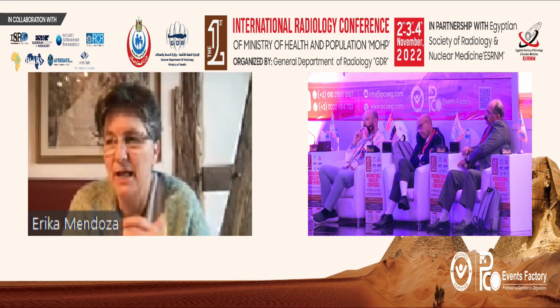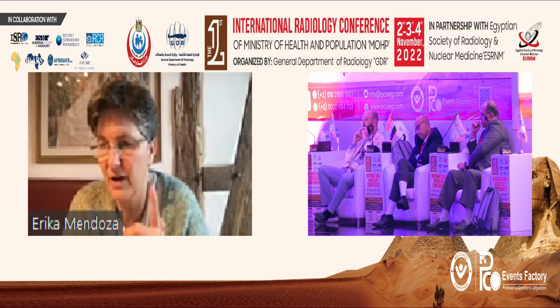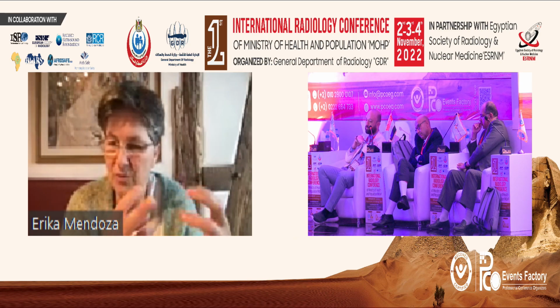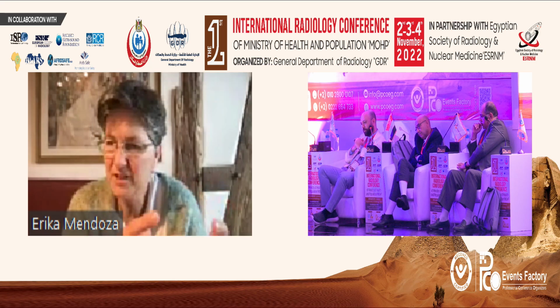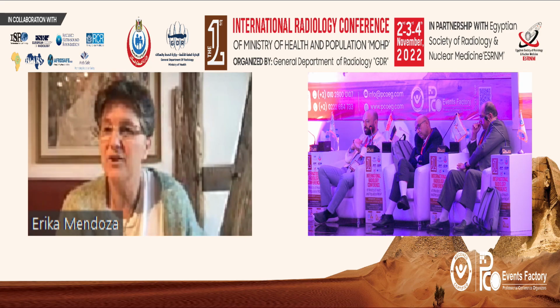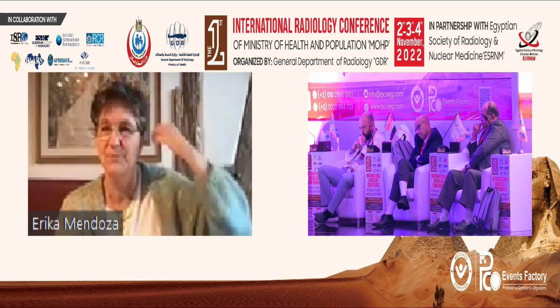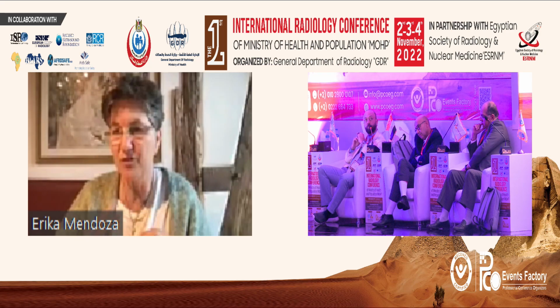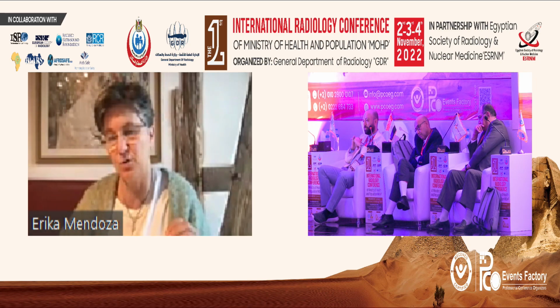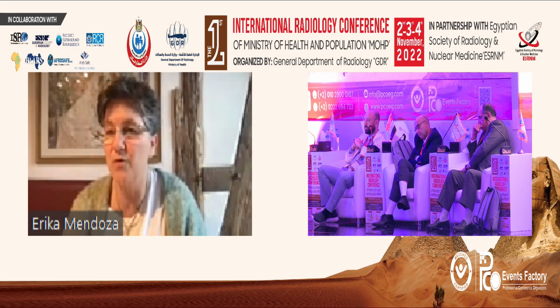Yes, very good question. I do this in the patients that have clinical symptoms of varicose disease, and I don't find the reflux. As I told you, these are usually female patients with very soft tissue, and they have edema, and they have pain in the ankles, and compression helps, and you don't find the reflux. If you go to the physics, a short reflux doesn't bother the transmural pressure as much as a long-lasting reflux, because all the time the reflux is running, you have a higher transmural pressure, and possibly this provokes edema.